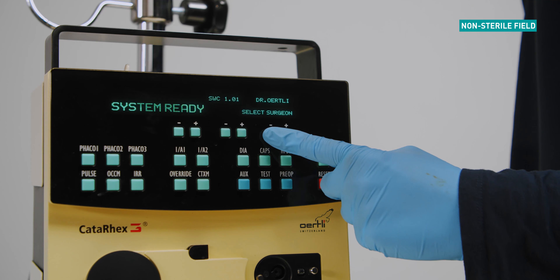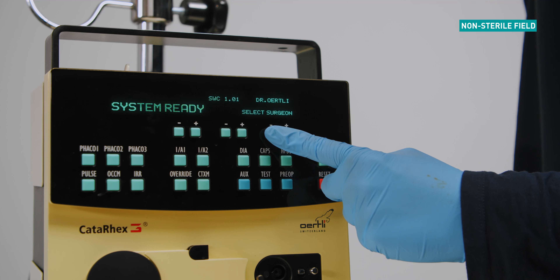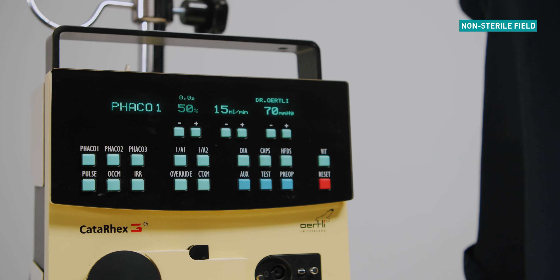From the startup screen, select the desired surgeon from the memory using the plus and minus keys on the upper right hand side of the display panel. Select FACO using the function key on the display panel.